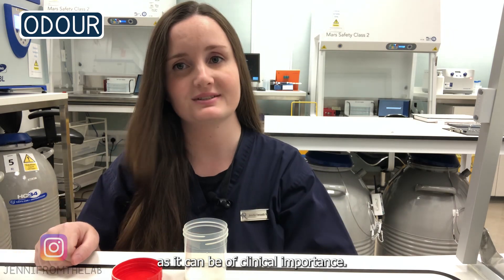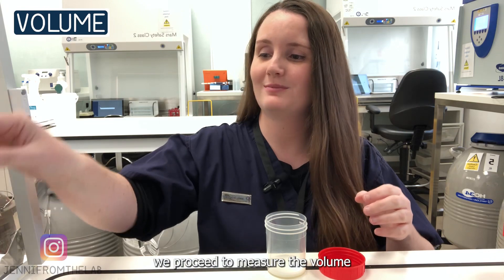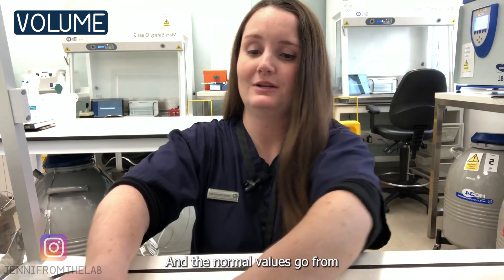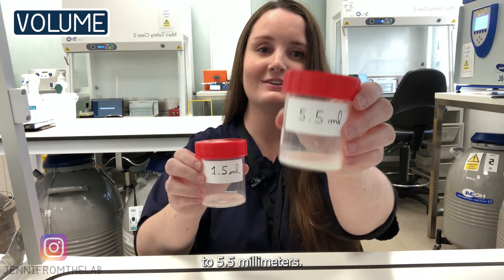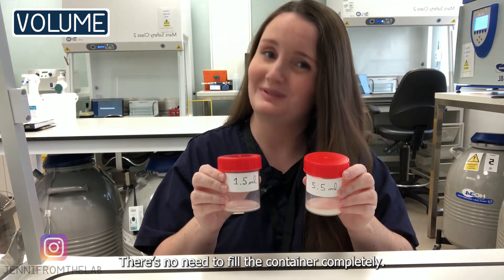Once the container is open, we proceed to measure the volume with a plastic disposable pipette. The normal values range from 1.5 milliliters to 5.5 milliliters. There is no need to fill the container completely.